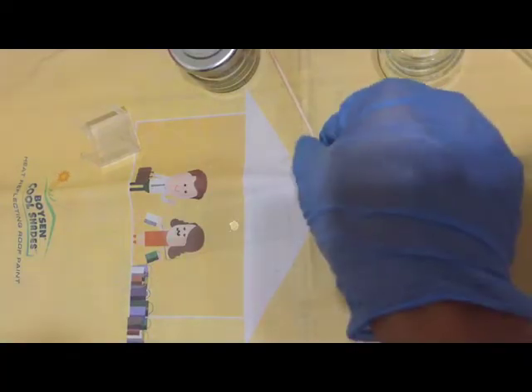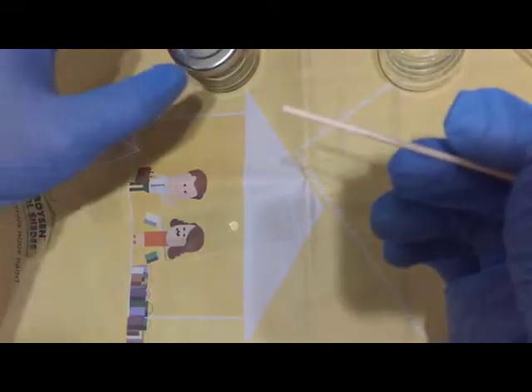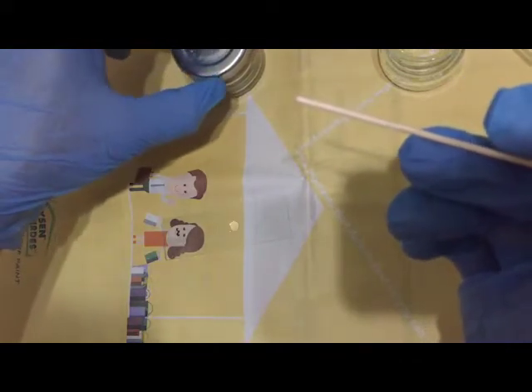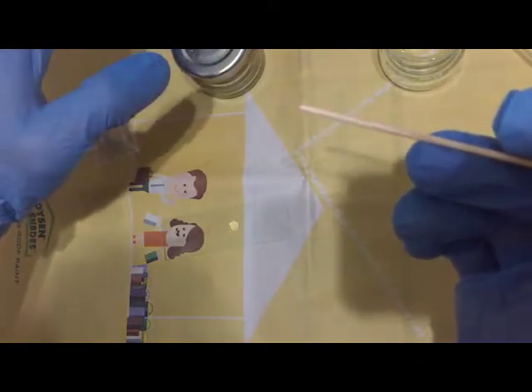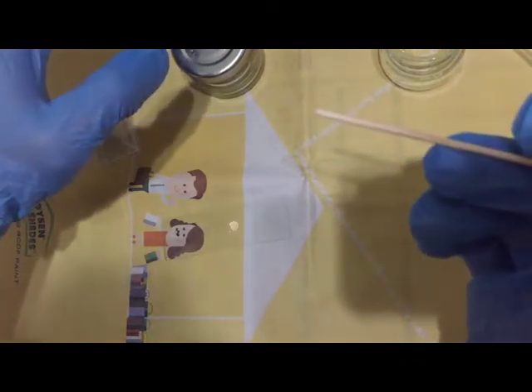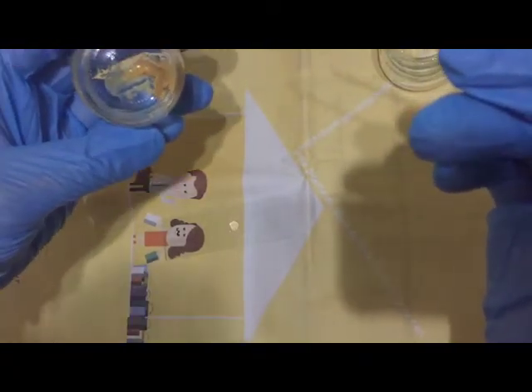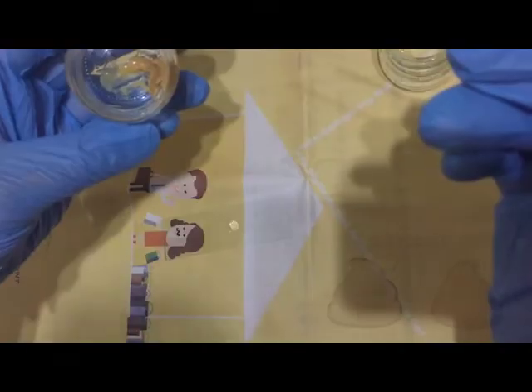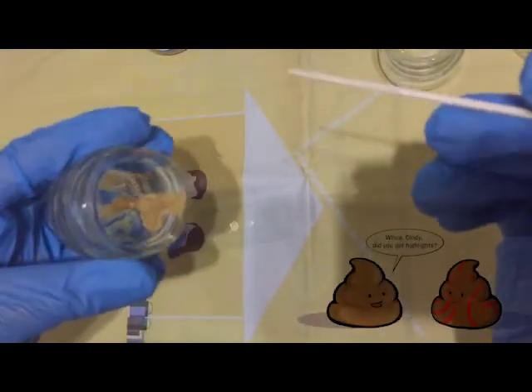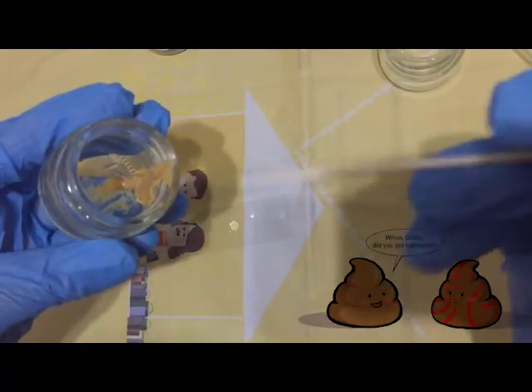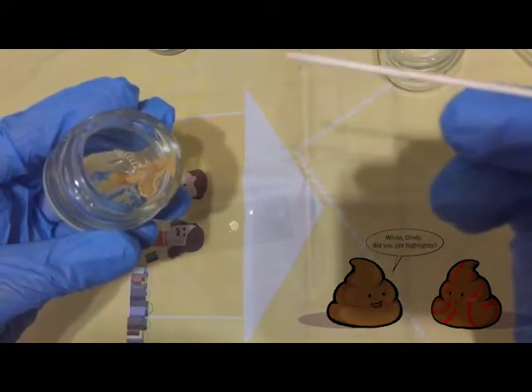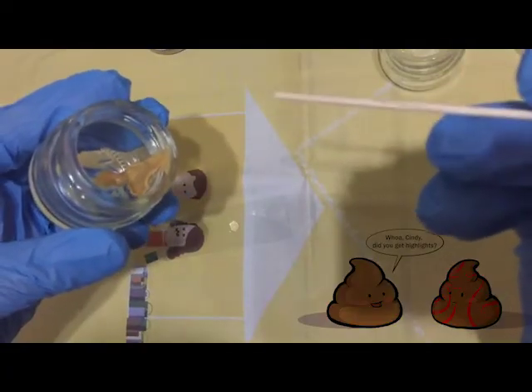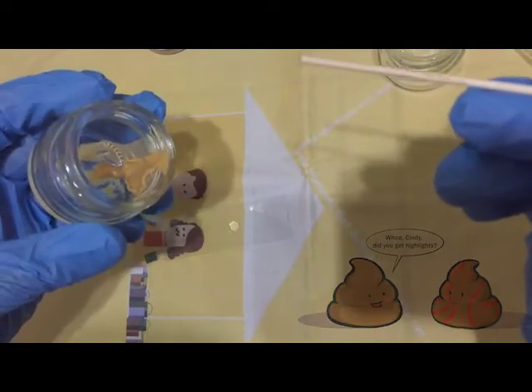Using an applicator stick, pick up the stool material from the best portion of the specimen. What is the best portion of the specimen? You try to look for areas with streaks of blood or mucus so as to increase your chances of actually getting any infected material.